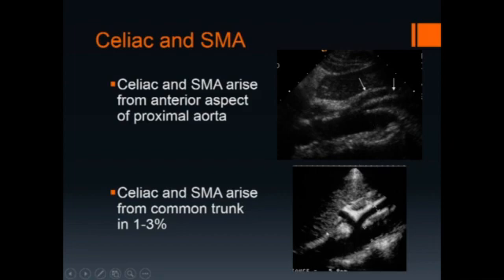In 1 to 3% of patients, the celiac artery and the SMA arise from a common trunk. This is the common trunk coming off here and giving off the celiac and the SMA from the abdominal aorta.